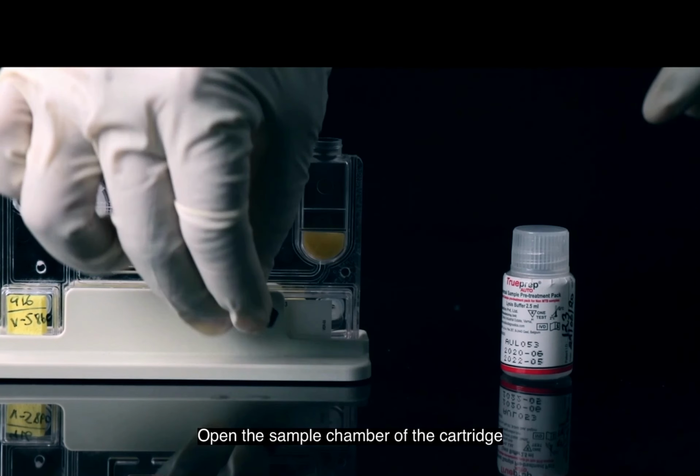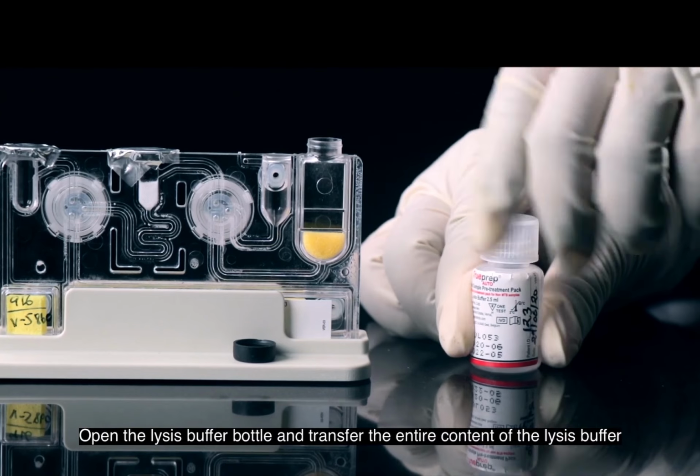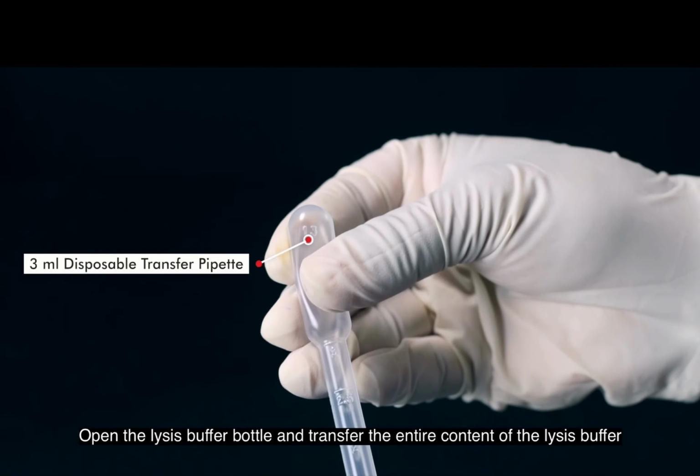Then open the cap where you put the sample. So now this lysis buffer, remember it had 2.5 ml and then you added 0.5 ml of sample to it. So total 3 ml of liquid is there in it. That is why they have provided a 3 ml disposable transfer pipette. So now you have to be careful and follow all the steps again. Press this bulb fully, and only then put it inside the lysis buffer bottle. And if you don't get the quantity fully, till 3 ml, if it doesn't reach, there's no issue. You can do it slowly in the next step also.